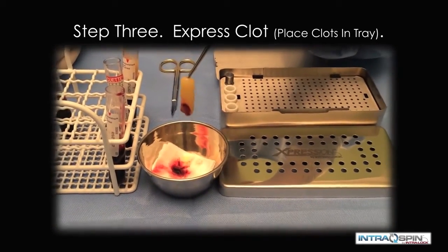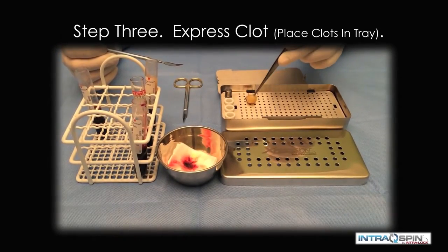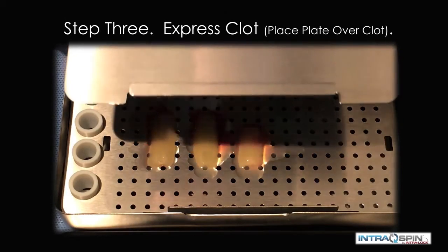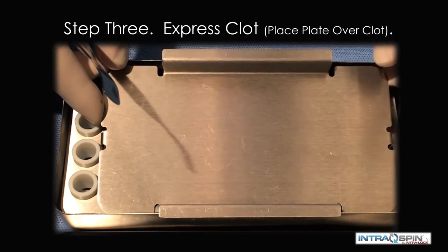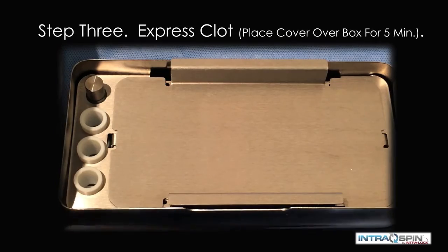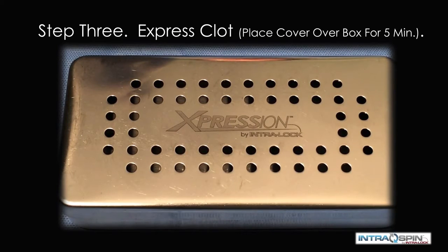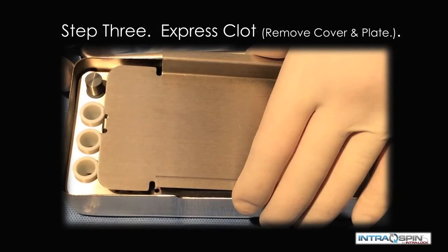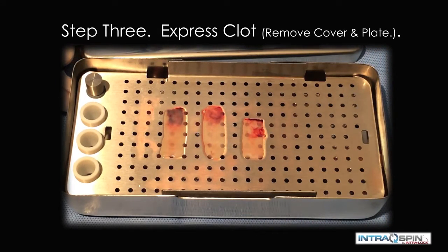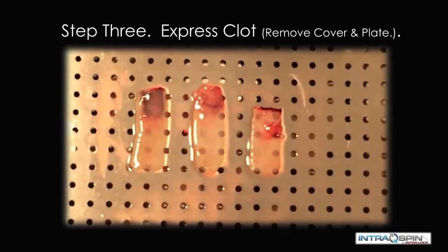The fibrin clots are now delivered to the expression box. They are placed on the perforated tray, and a compression plate is then placed over the fibrin clots. A weighted cover is placed over the compression plate and allowed to sit for approximately five minutes while the serum is compressed out of the material. When the compression plate is removed, we find three beautifully compressed fibrin membranes.